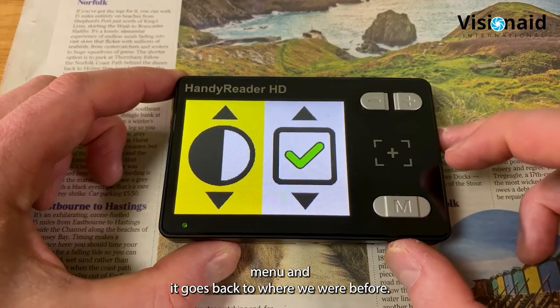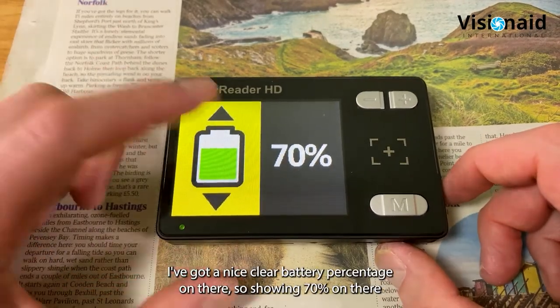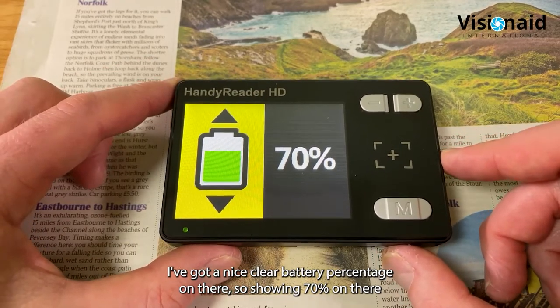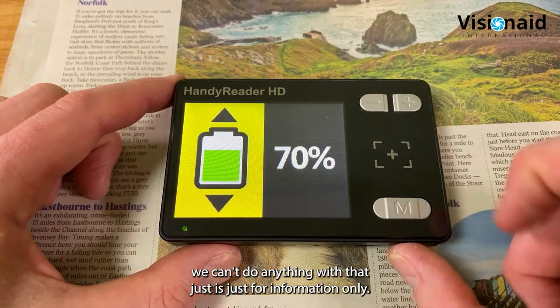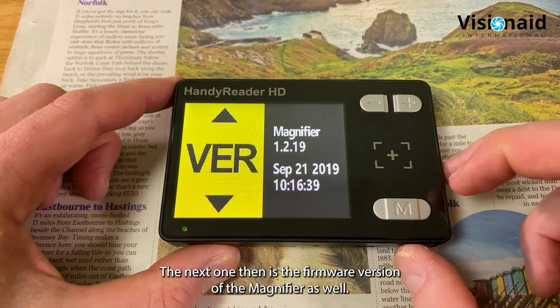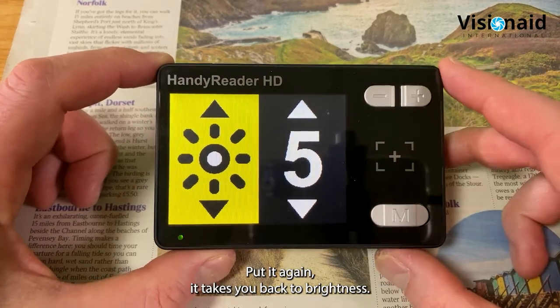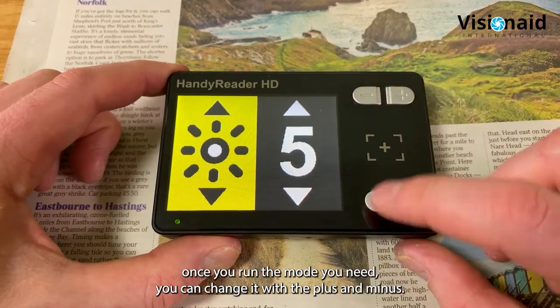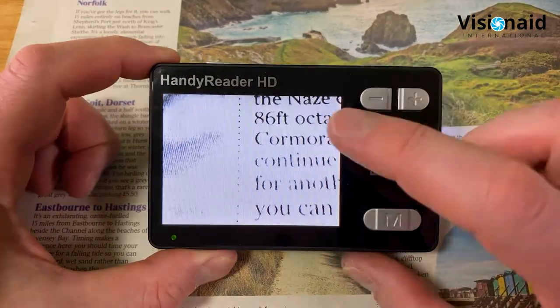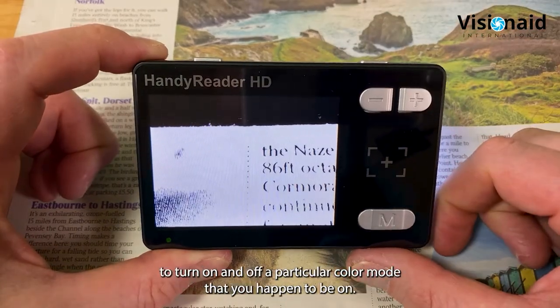Scrolling through the color modes, yellow and blue or blue and yellow is another popular option. Find the color you want and click the freeze frame button to turn it on. Coming out of the menu, that color is now added to the cycling list. Many users just want white/black and black/white, so they turn off all other color modes so they don't have to cycle through a long list. The menu also shows battery percentage - currently 70% - and the firmware version, then cycles back to brightness.